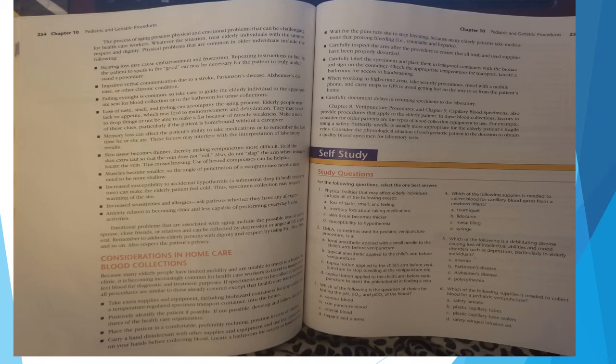Skin tissue becomes thinner, thereby making venipuncture more difficult. Hold the skin extra taut so that the vein does not roll. Also, do not slap the arm when trying to locate the vein. This causes bruising. Use of heated compresses can be helpful. Muscles become smaller, so the angle of penetration of a venipuncture needle may need to be more shallow. Increased susceptibility to accidental hypothermia, a subnormal drop in body temperature, can make the elderly patient feel cold. Thus, specimen collection may require warming of the site. Increased sensitivity and allergies: ask the patient whether they have any allergies. Anxiety related to becoming older and less capable of performing everyday living activities.